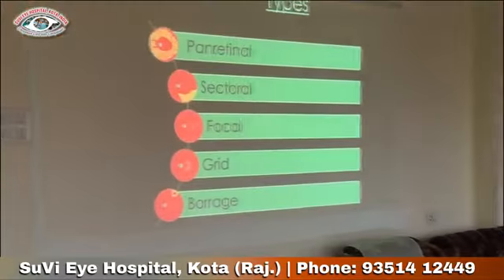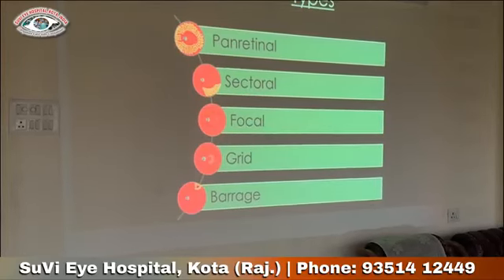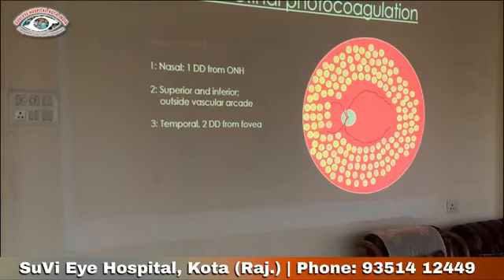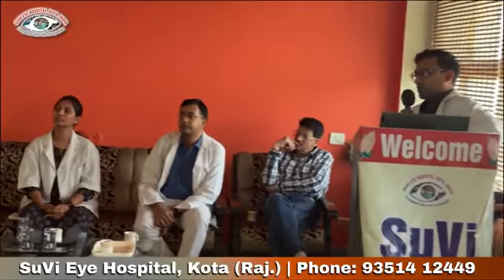The types of retinal lasers are panretinal photocoagulation, sectoral, focal, grid, and barrage. A rule of thumb is that macular lasers like focal and grid always require significantly lower parameters than peripheral laser applications.